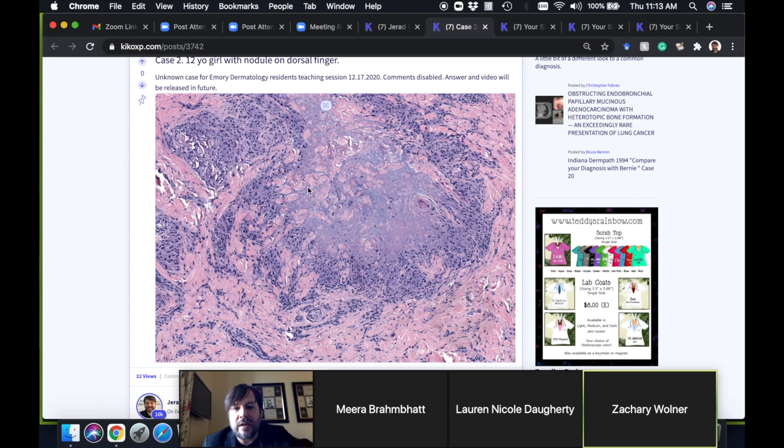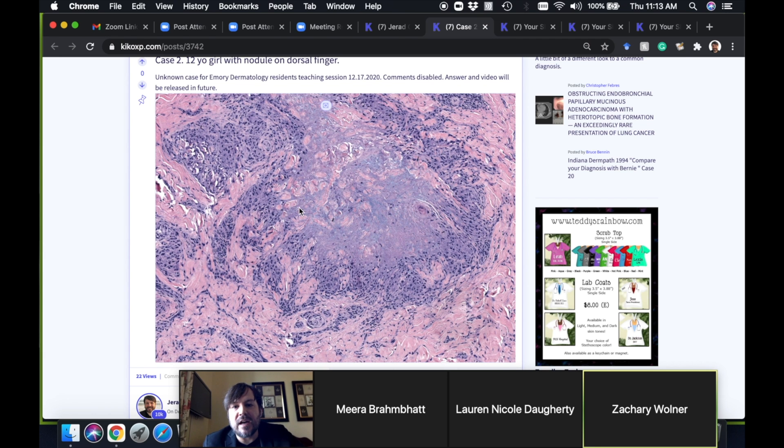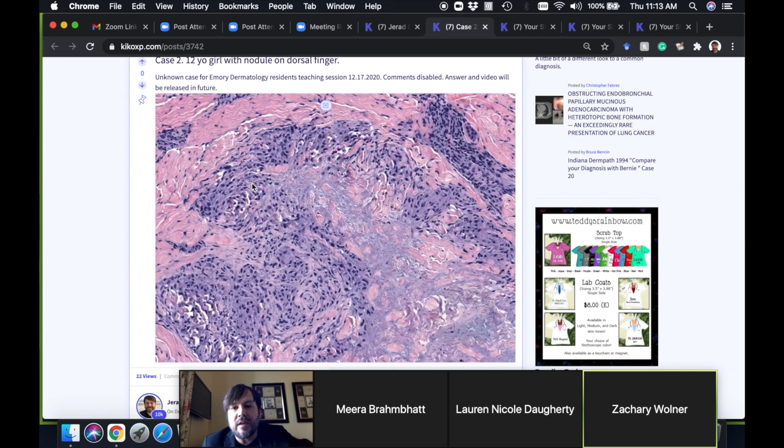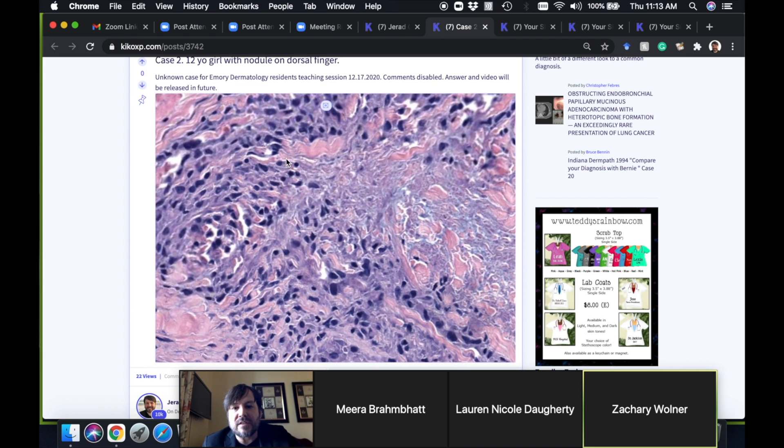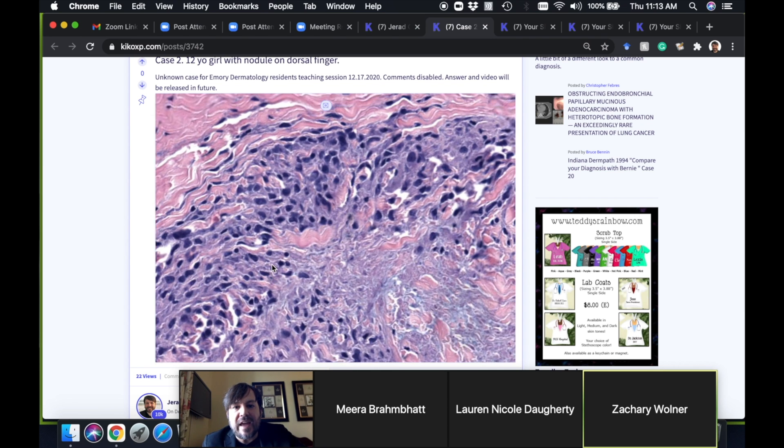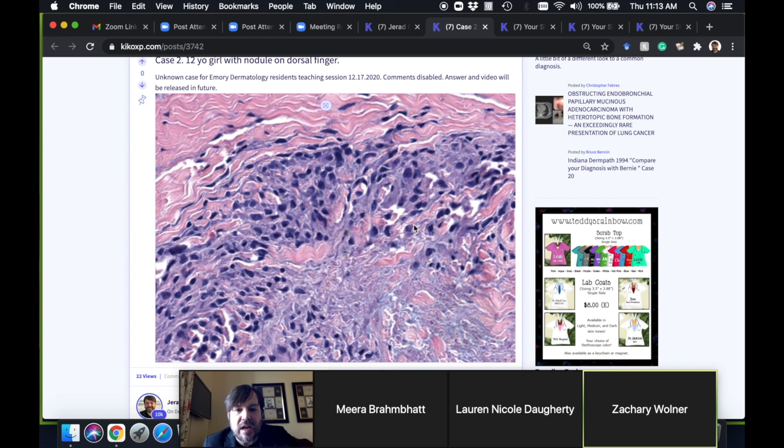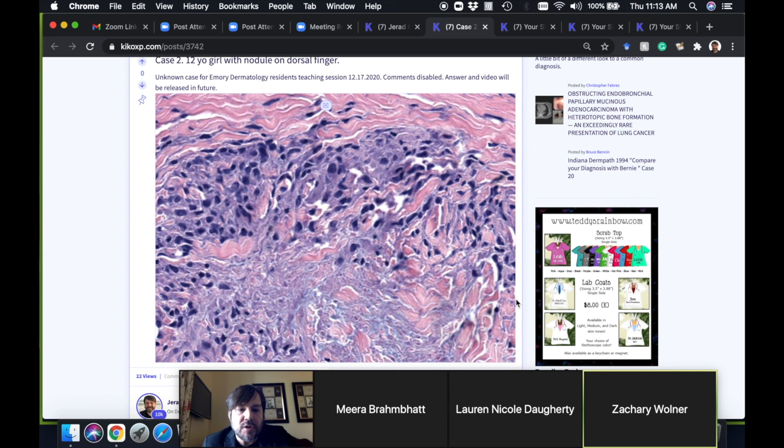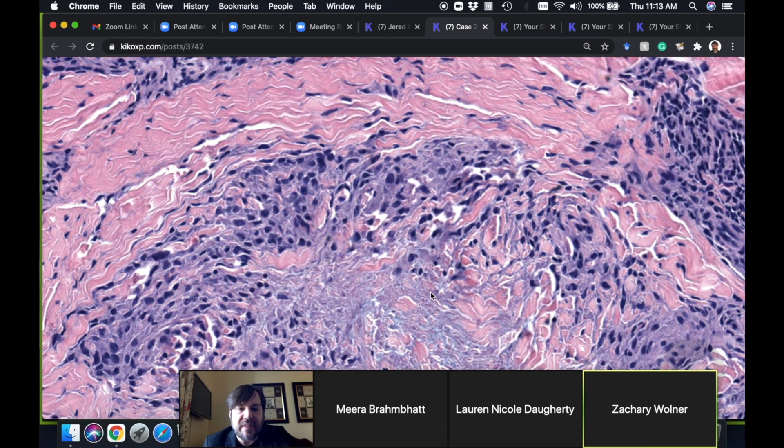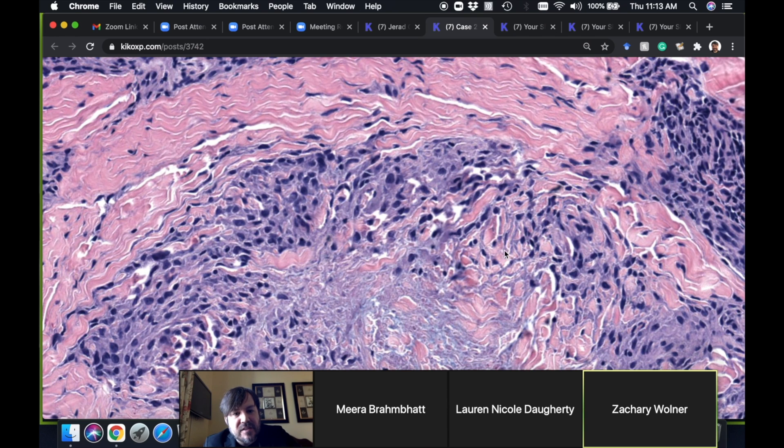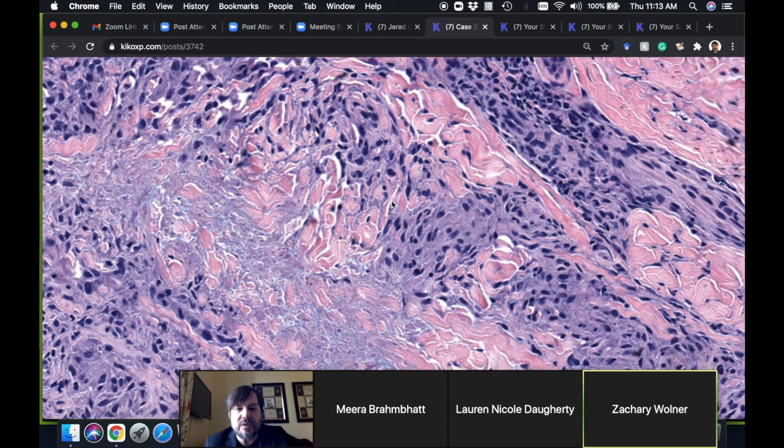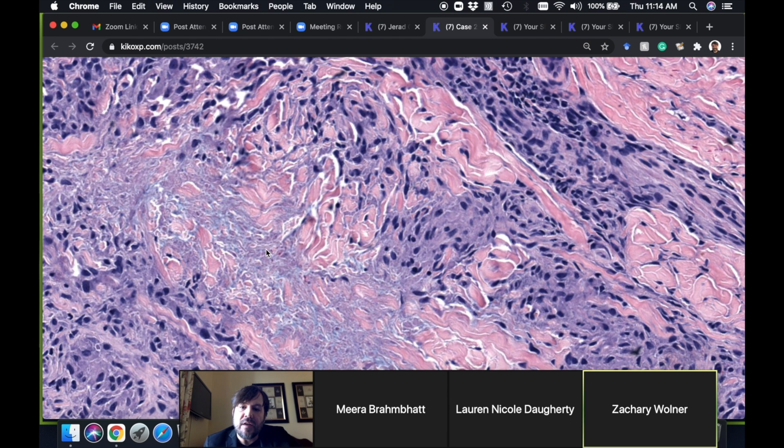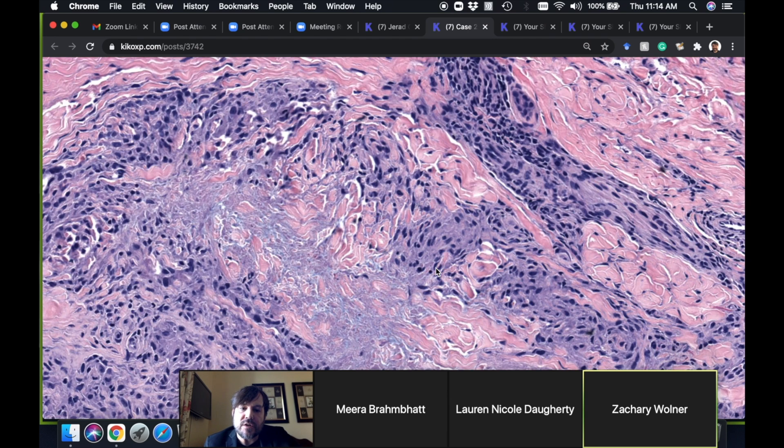Let's look at the cells around the outside here. Again, bland histiocytes, kind of oval to spindle nuclei. They palisade around the outside just like we saw in rheumatoid nodule, but here there's a bluish center.